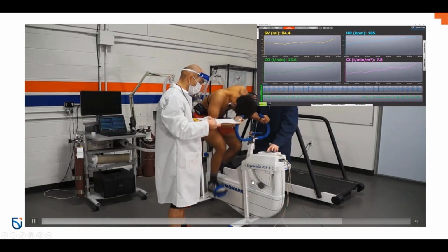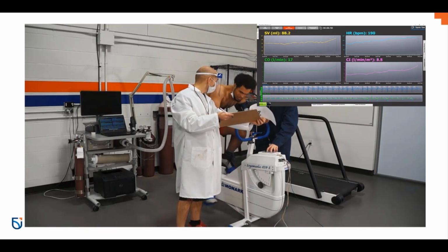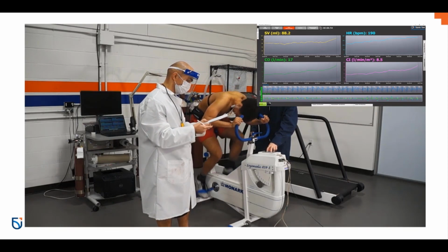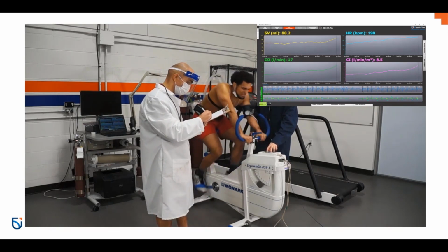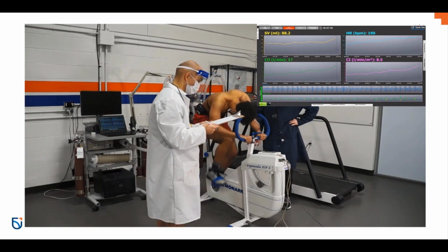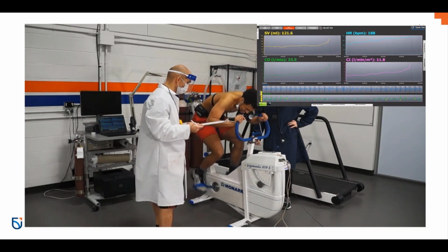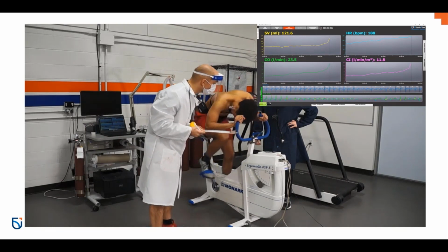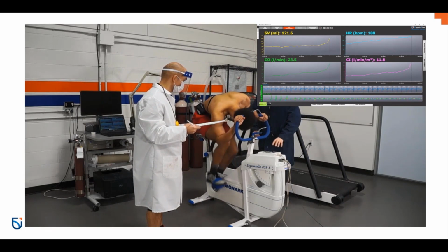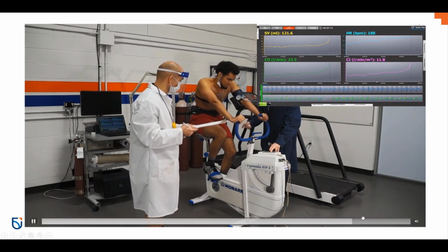This is a digitally braked bike, meaning it will adjust the wattage based on his RPMs. So if he slows down, the amount of actual physical resistance on the wheel goes higher, so it equates to the same amount of work per revolution. But it actually is kind of slow to adjust, so I still am encouraging him to stay at 70 RPMs. If you have a really, really high quality digitally braked bike, you can give them a general range, but they'll go at whatever you need them to be.